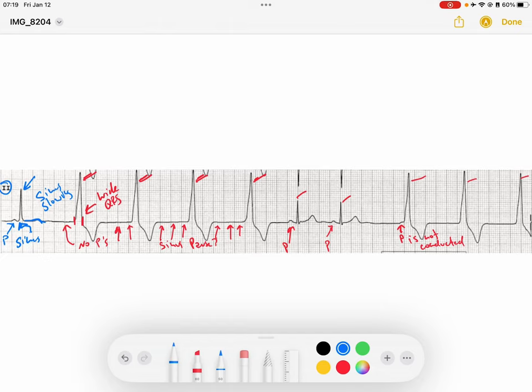And then when the sinus node picks back up, when the sinus node goes faster, it takes over the rhythm and it captures the ventricles itself with these nice narrow QRSs.